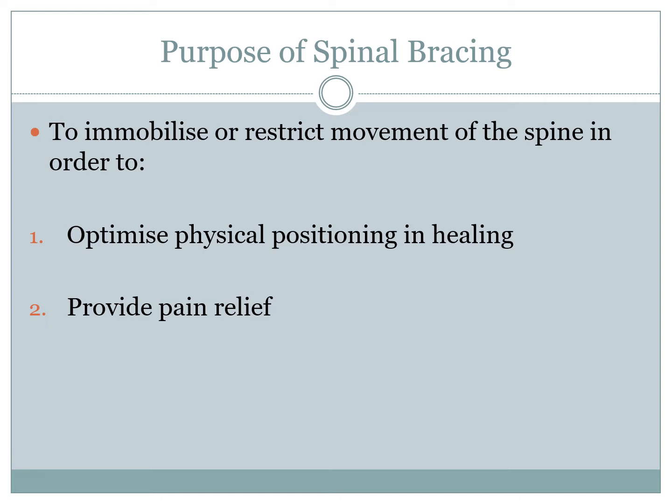For example, for acute vertebrae fractures, they help to minimize instability or the likelihood of the fracture impinging on the spinal cord. Once fitted appropriately, the brace can also help to prevent spinal deformities such as subsequent kyphosis due to injury. The second reason is to provide pain relief. A correctly fitted brace offloads weight and pressure exerted through the spine and therefore can reduce pain.